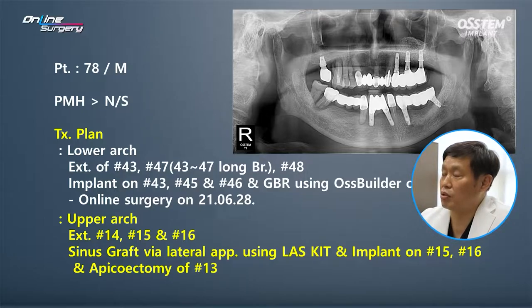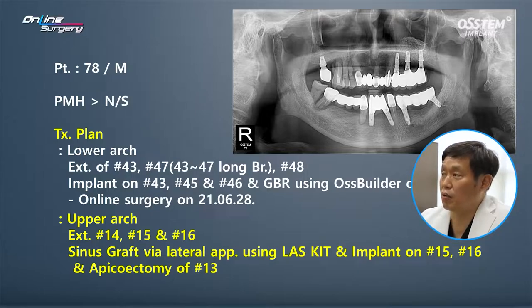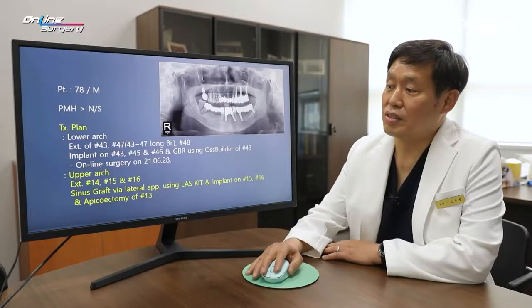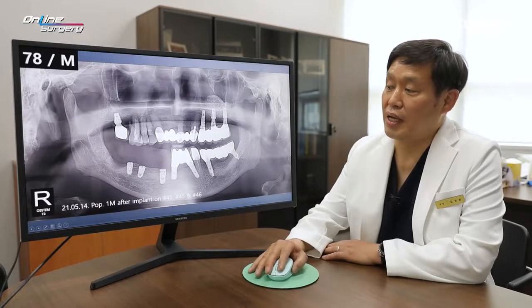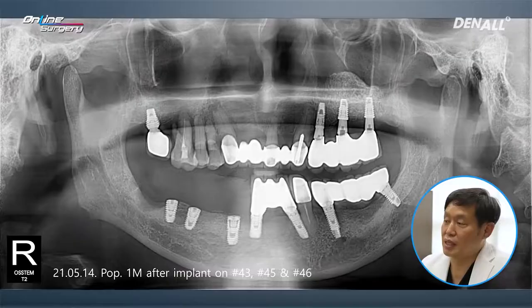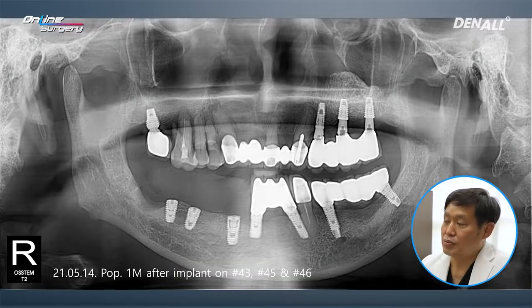Apicoectomy is going to be done. Endodontic treatment is going to be provided so that the patient can use the long bridge on the anterior side. Apicoectomy was planned in May 2021. Three implants were placed in the lower posterior, and OzBuilder was used in number 43 for GBR.